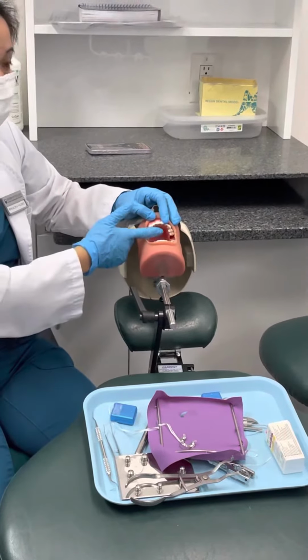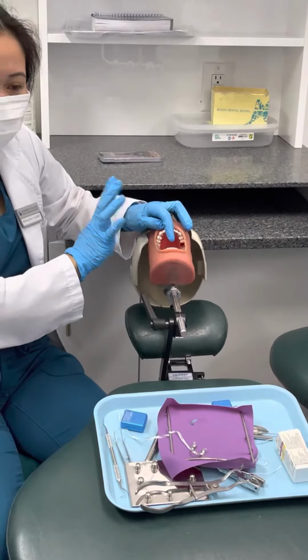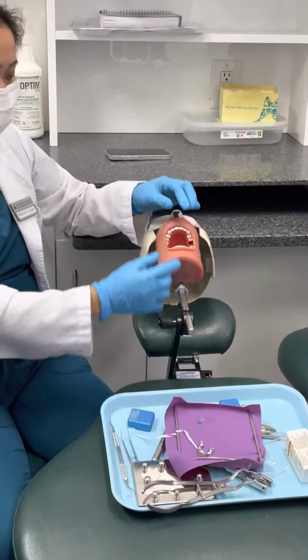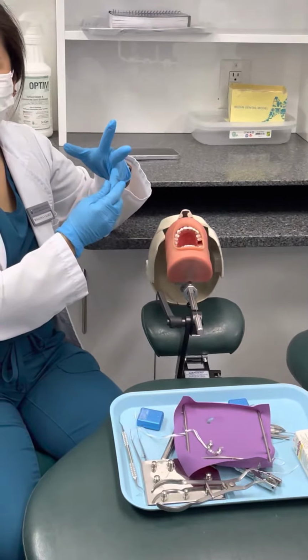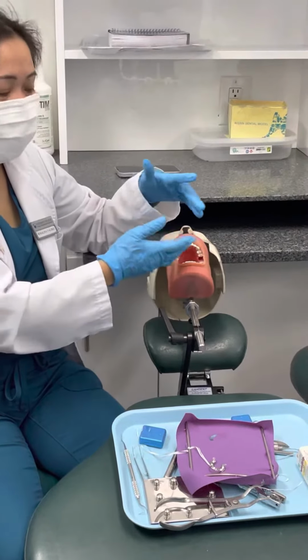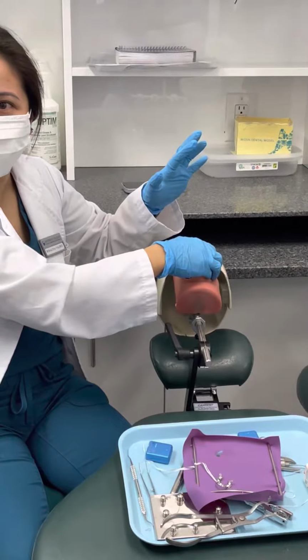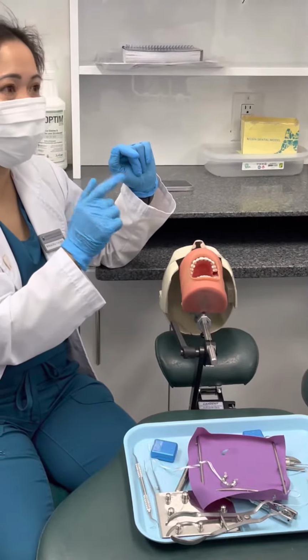Another reason is if the teeth have lots of plaque, like tartar. It's covered with tartar. You cannot put this in between because it's covered with tartar. What else? If there are lots of missing teeth, because there's no way to stabilize it. If the whole set of teeth is missing, how can you? There's no way to stabilize the dam on the other side, unless it's a root canal, as I said, because it's only one tooth, right? What else?